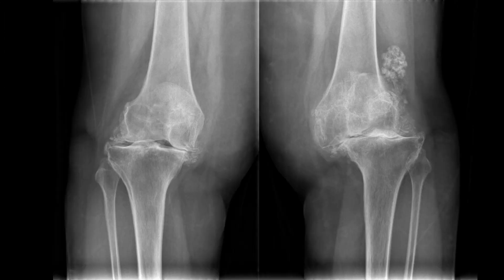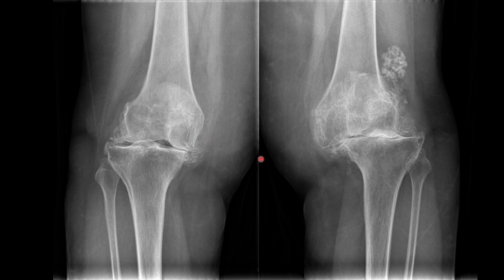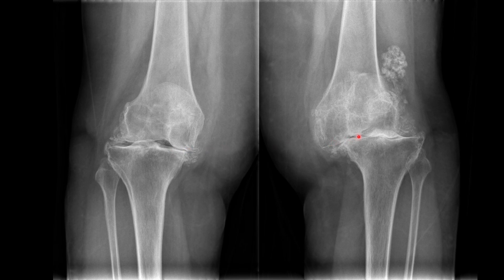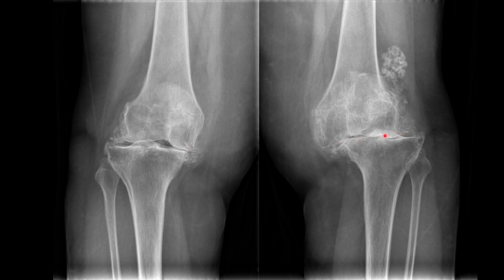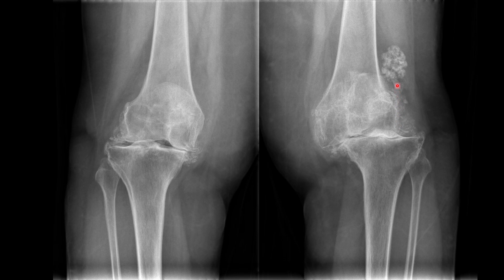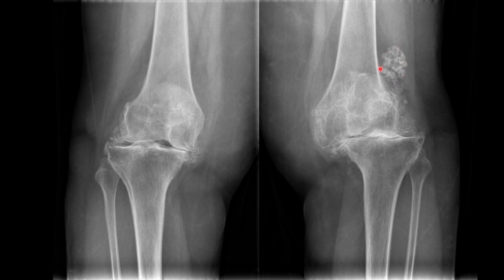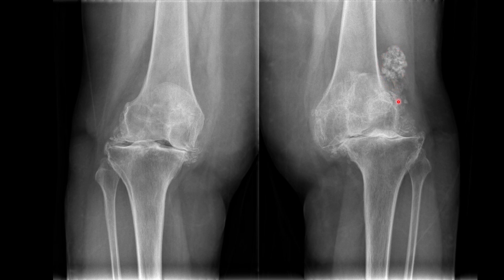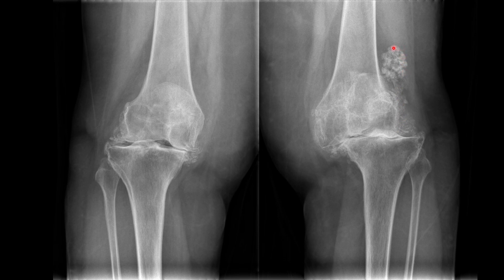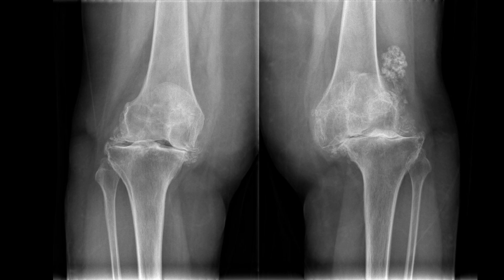There is a lot going on in these images. This is the same patient — you'll notice an increase in patient body habitus by the size of the subcutaneous fat. There is significant loss of joint space bilaterally. Note the alignment changes and changes to the articular surfaces of the femoral condyle and tibial plateau. The large soft tissue calcification is actually within the joint — these are intra-articular loose bodies, which occur when the hyaline cartilage lining the joint breaks off, becomes free floating, and then calcifies inside the joint. This patient has significant findings and will need to consult with an orthopedic surgeon.